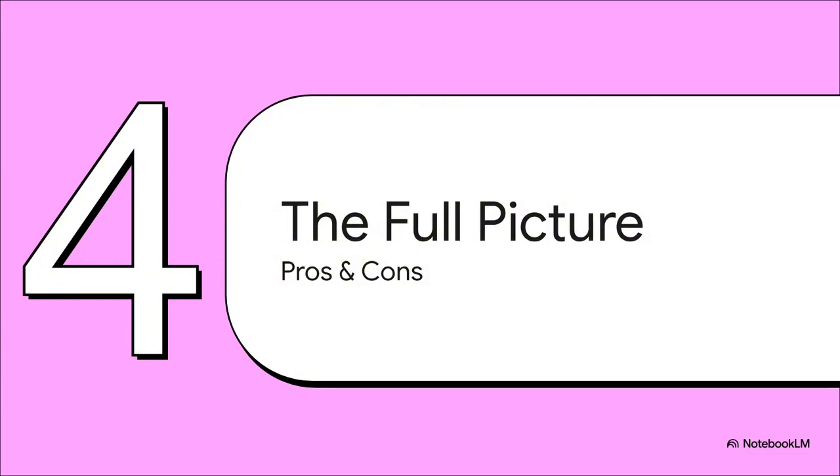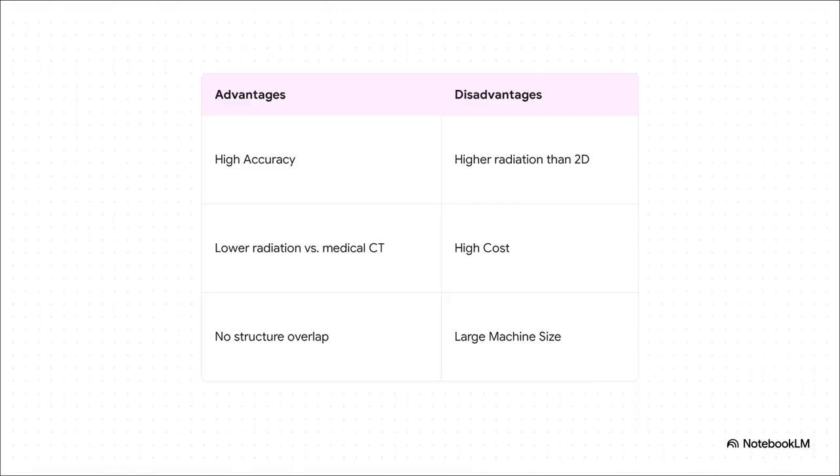Now, look, no technology is a magic bullet, right? It's not perfect. So, to be fair, we got to look at both sides of the coin. Let's get into the pros and cons. So, on the pro side, the accuracy is just incredible.